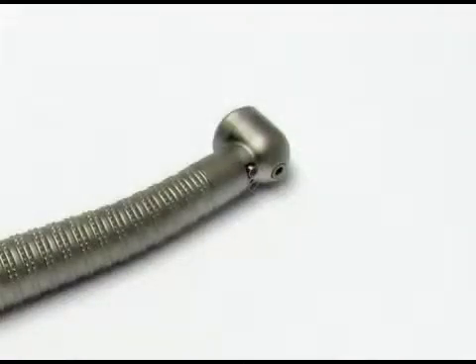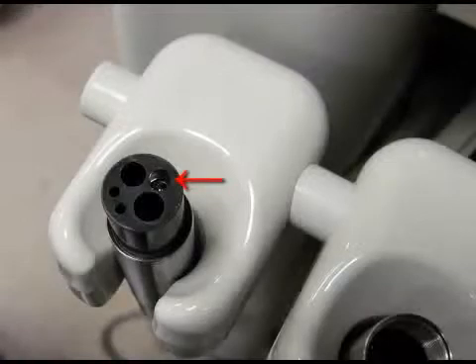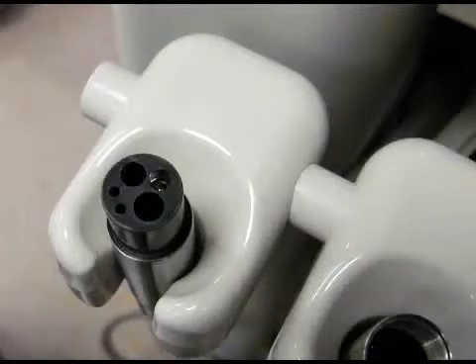Some VetPro 1000 units are equipped with a fiber optic light for the high-speed handpiece. If that is the case, the bulb will already be installed on the hose in the first position on the left side of the unit. Now, let's go through each.